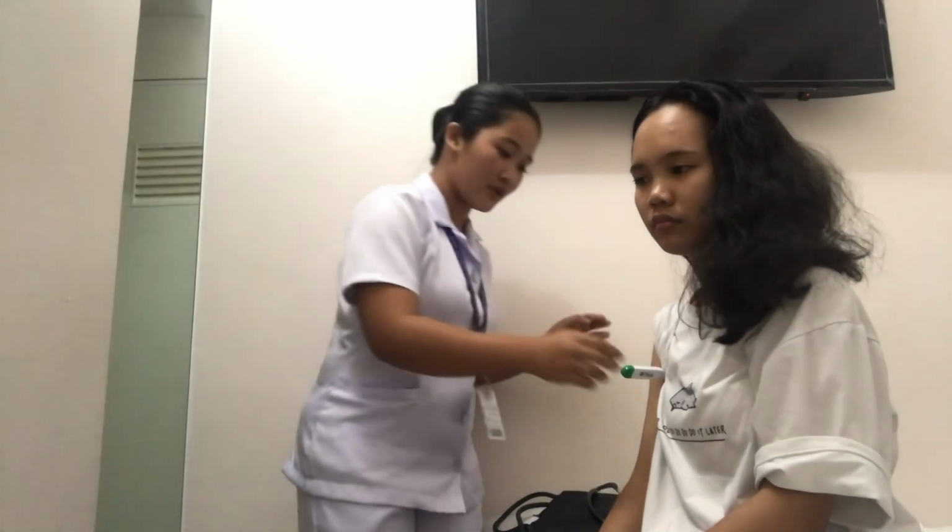After that, I have to inform the patient about the result of her temperature and disinfect the thermometer. Perform hand hygiene after that and document the data that I've gathered.